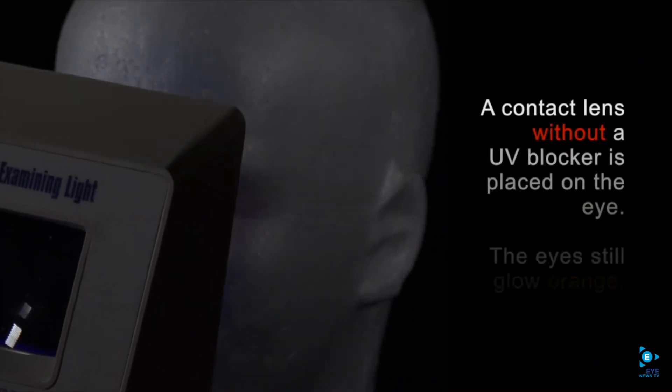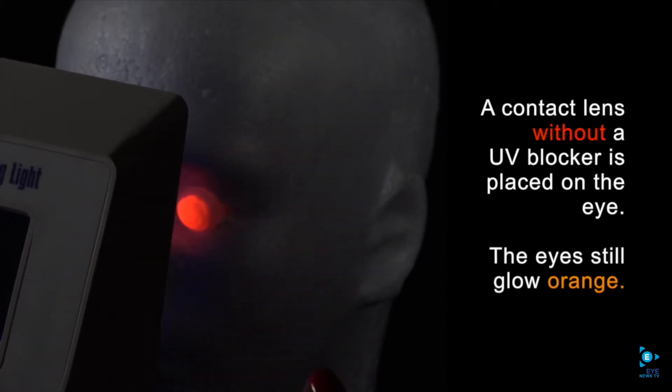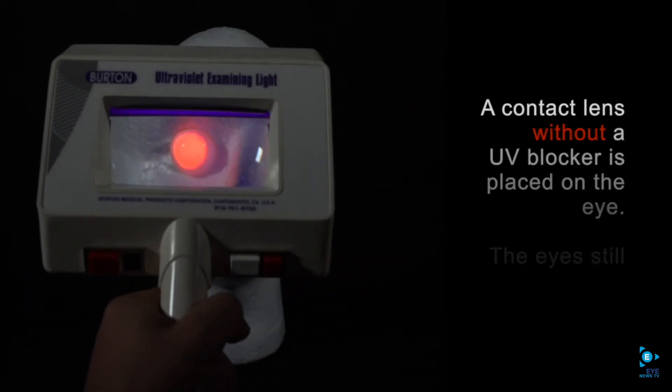Next I'm going to place a contact lens on his right eye that does not contain a UV blocker. And you can see that the orange glow continues.